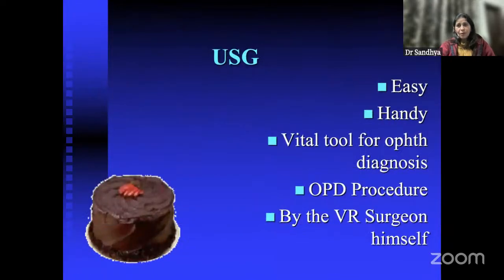So once you go ahead with ultrasound with the clues and features in your mind, that is why in my initial slides I said that it is important for the clinician to do the ultrasound yourself rather than just giving it to your technicians or to the radiologist. Only once you do it yourself will you know what you have to look for, and you will have the best information.